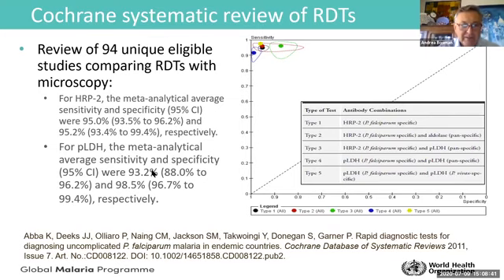Why do we have a little better specificity with the PLDH-based test? We will go very much in detail in this in the next presentation, not today, but I just want to quickly assess if you knew it. Nobody? I don't see a reply. So let me move to the next.